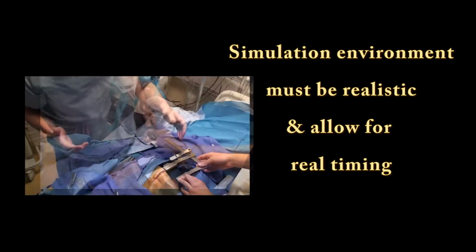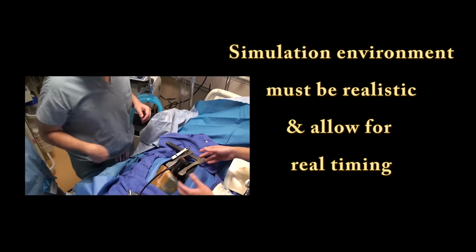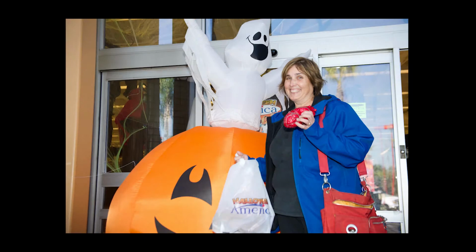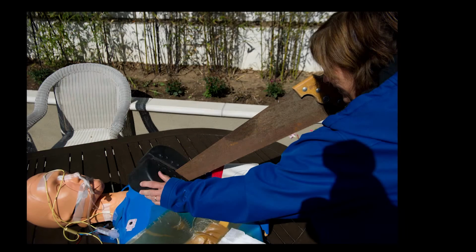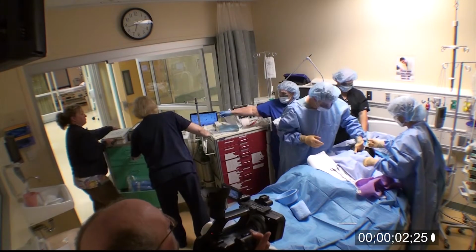However, many low-volume, low-resource ICUs don't have the funds to purchase commercially available realistic simulation equipment. By being creative, we're able to develop a reusable, realistic simulation patient for under $50 by finding an old CPR mannequin and purchasing a few items from the Halloween store. In less than 4 hours, using a plastic heart and fake wound, we transformed an old CPR mannequin into a realistic simulation open heart patient that allowed for all the steps of the procedure to be performed in real time.